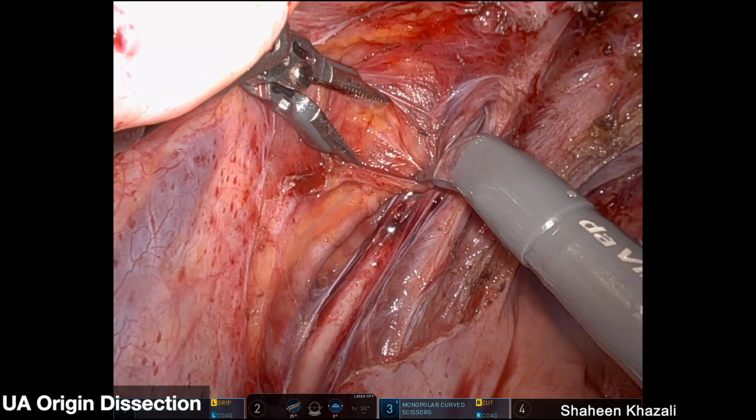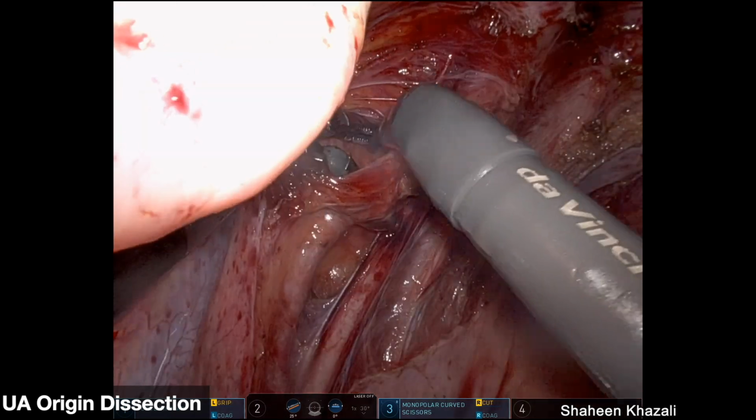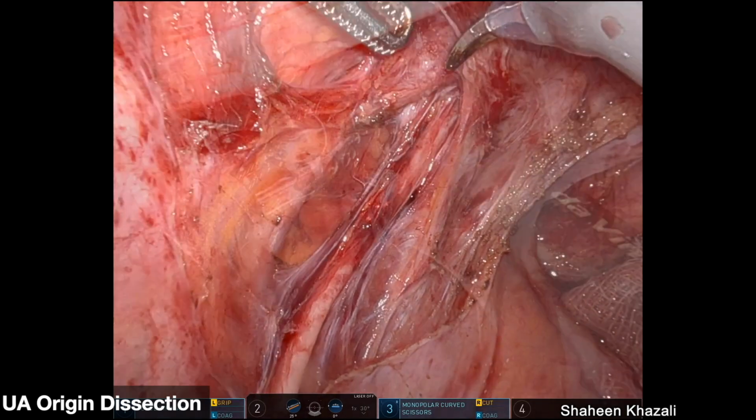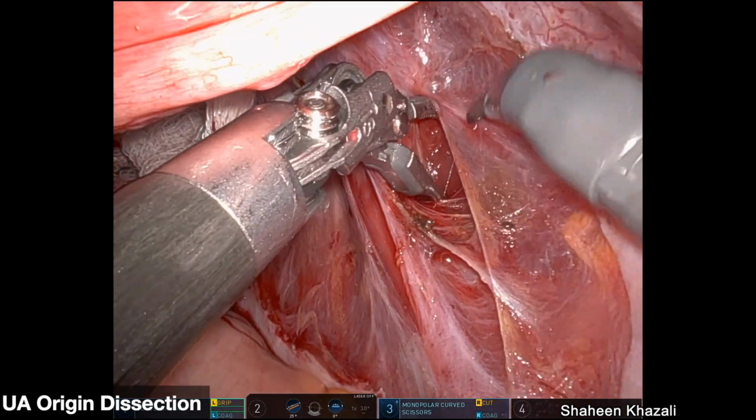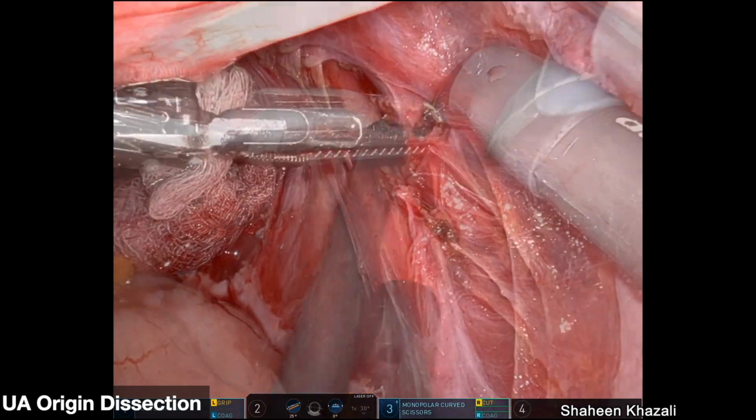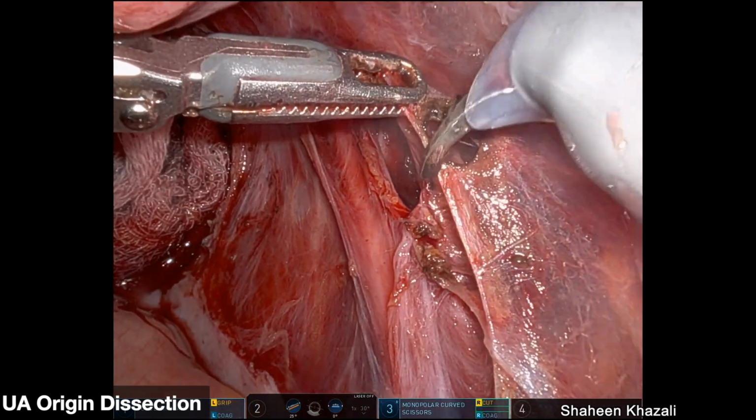So once this is complete, the origin of the uterine arteries is dissected and displayed here. This is done bilaterally, and this is to then facilitate the placement of temporary vascular clips.